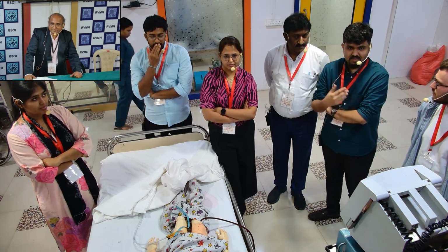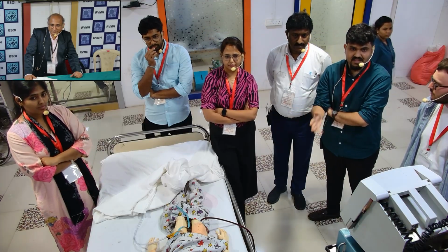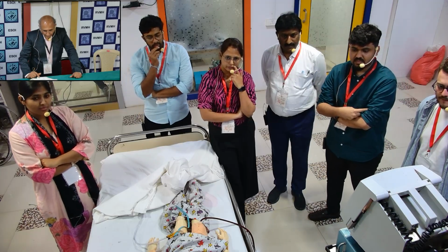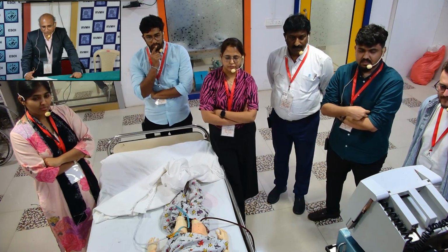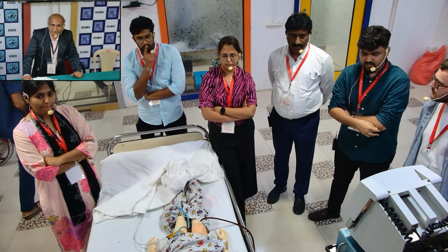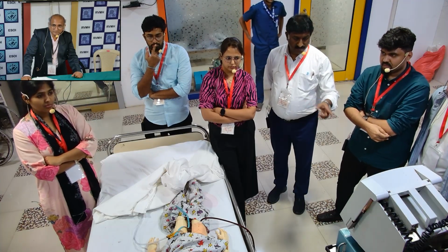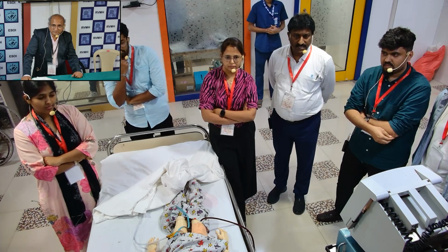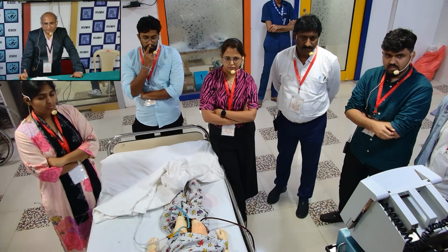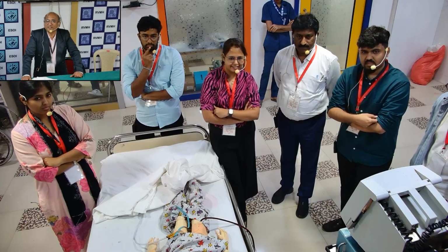You have to be strong with the basics when you're understanding your patient. So first, analyze your patient before you jump to any conclusions. Examine the patient first. Yeah, examining the patient is very important. The way you follow head to foot, or you follow drainage to return or return to drainage. Look at the flows, whether increasing or decreasing, the P1 pressures, to identify if there is any problem over here. So look at the RPM flow ratio and the circuit pressures. Fine. A systematic approach should have been there.